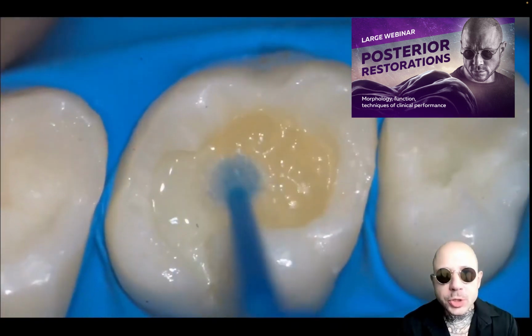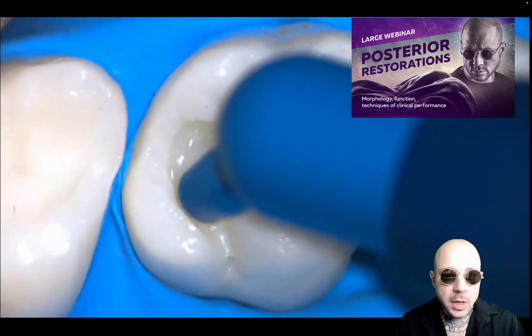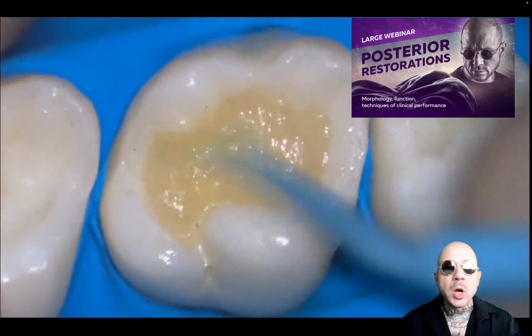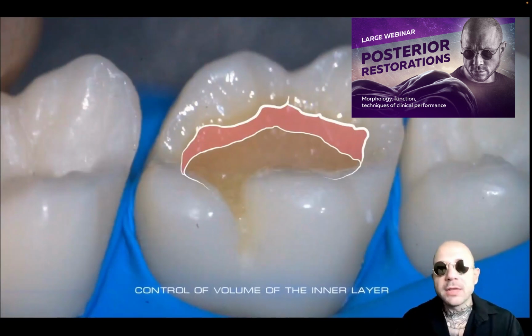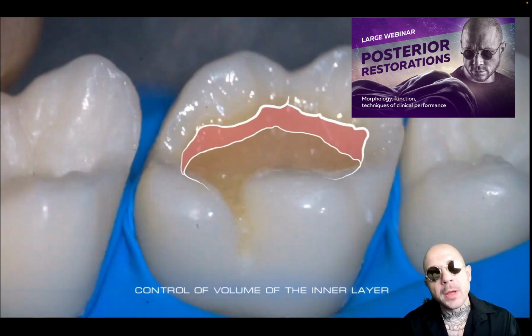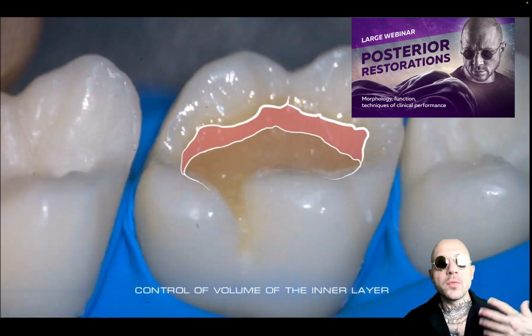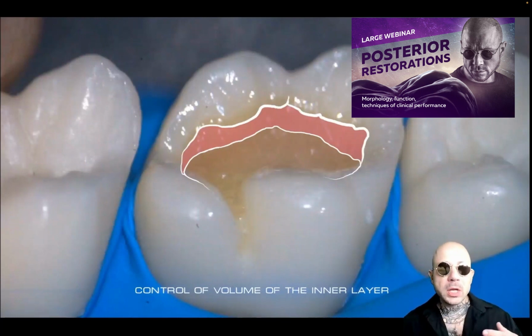As the first layer, I usually fill the excesses of free space under the cusp in the defect, because under the cusp the defect size is the biggest usually, with some over big free space inside, and it's necessary to fill it at first with some separate portion before doing the ridges themselves, because in case we would not fill those areas with the portion before applying the ridges, in case of ridge applied, the portion with which we wanted to make a modeling of the ridge will be too small.